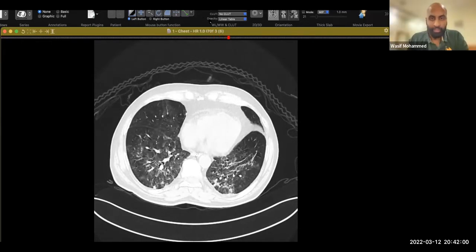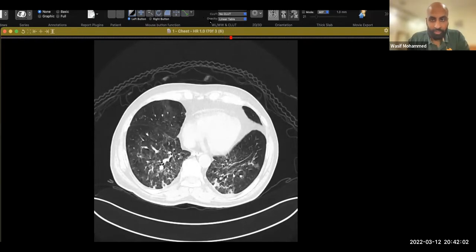All right. Okay, that's fine. So those were your cases. I think you did quite well. So we'll just start the discussion. Just give me one second. What was that case? This was PJP. Really? I don't see any pneumatoceles. It's not like a typical ground glassy appearance. Yeah, there might have been some chronic infection, like you said, but overall it was PJP.